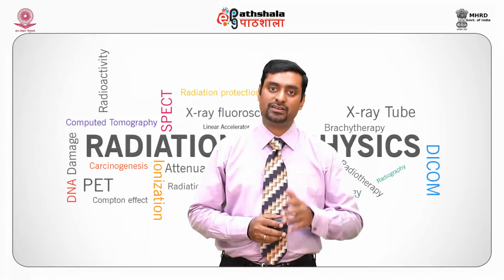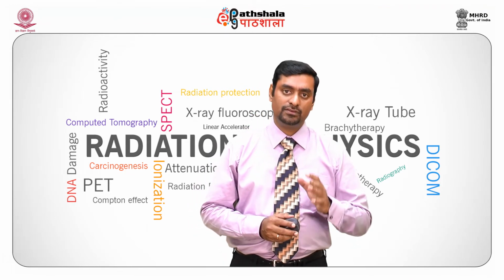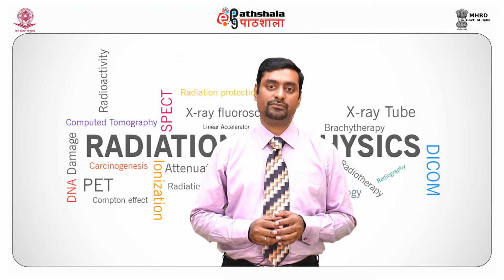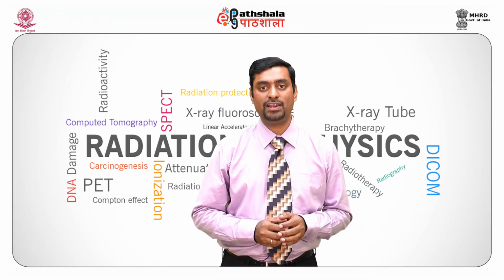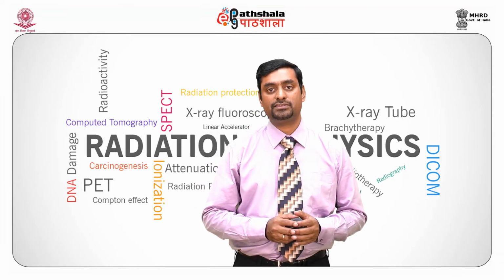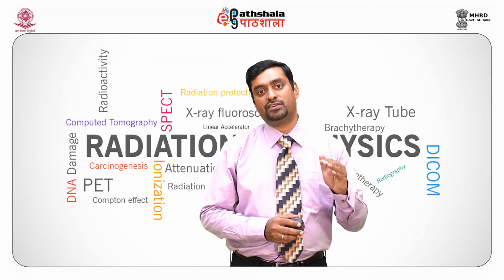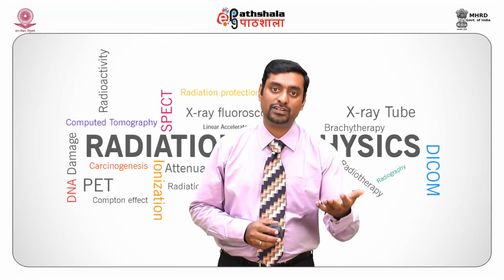When films are used directly, they have high spatial resolution. So, to get high spatial resolution, it is important to manufacture a detector which can directly convert X-rays to an image. In the indirect method, X-rays had to be converted to light and light into electrons.